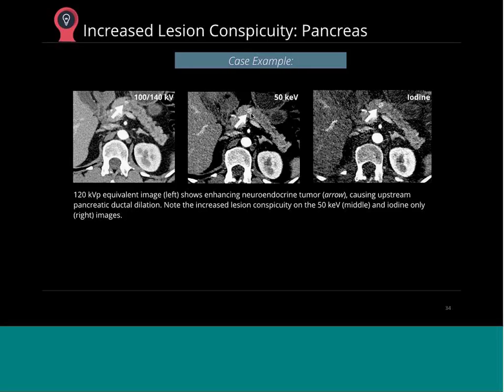It's a neuroendocrine tumor. This thing secretes hormones. This thing causes the patient a lot of symptoms, diabetes. It could cause GI ulcers. Okay, this little thing right here. All right, it's less than a centimeter, and this is what we're trying to detect because we're trying to tell the surgeon the thing that's causing all those symptoms, because this thing's secreting hormones, you've got to go and resect.